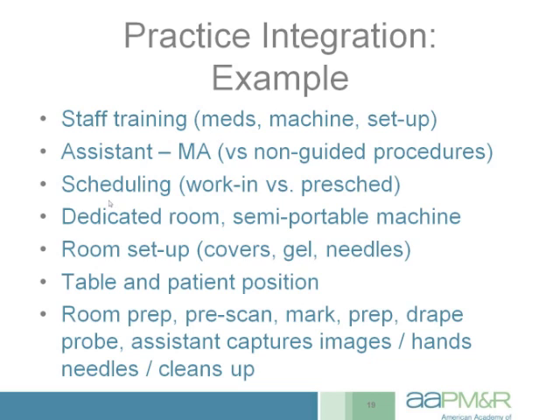In terms of scheduling, we do a mix of things. Sometimes if the orthopedic surgeon is sending me a procedure, we'll pretty much know ahead of time we're going to be doing an ultrasound-guided procedure that day. In some cases, I might be referred someone because the primary care physician thinks they have a cervical radiculopathy or a lumbar radiculopathy, and based upon my consultation, I think it may actually be a shoulder or hip joint source respectively. We may decide to do an ultrasound-guided procedure on the spot for diagnostic and therapeutic purposes. In the end, having some type of system in your practice which allows you to do these things efficiently will allow you to do it on the fly if that's what you choose to do.